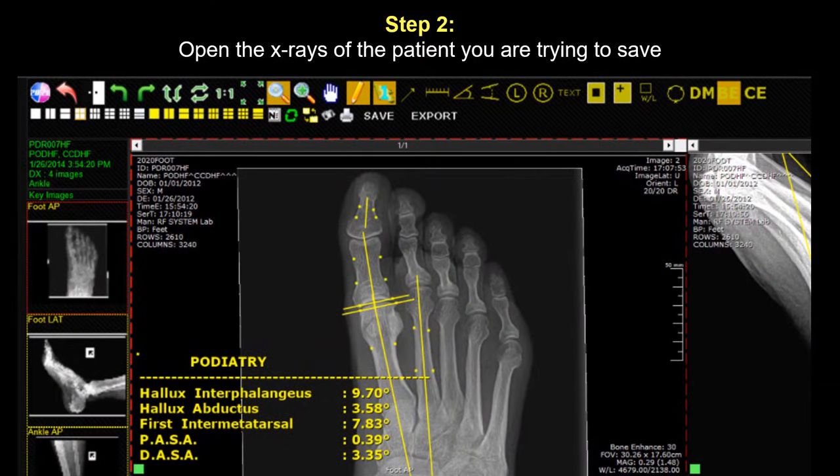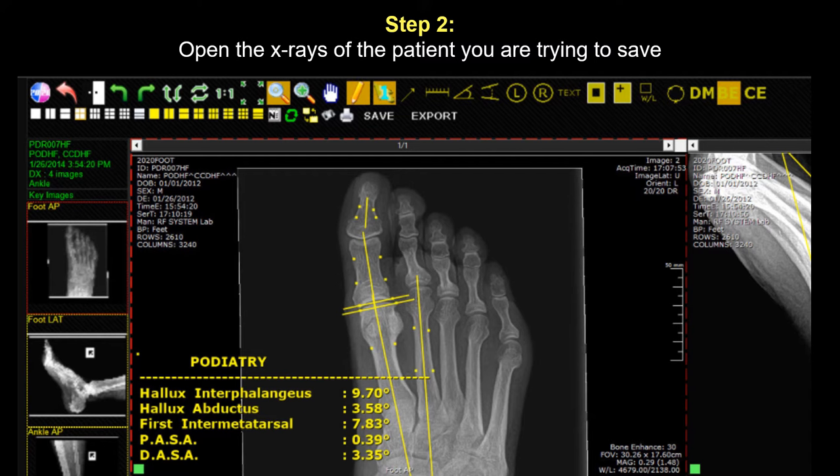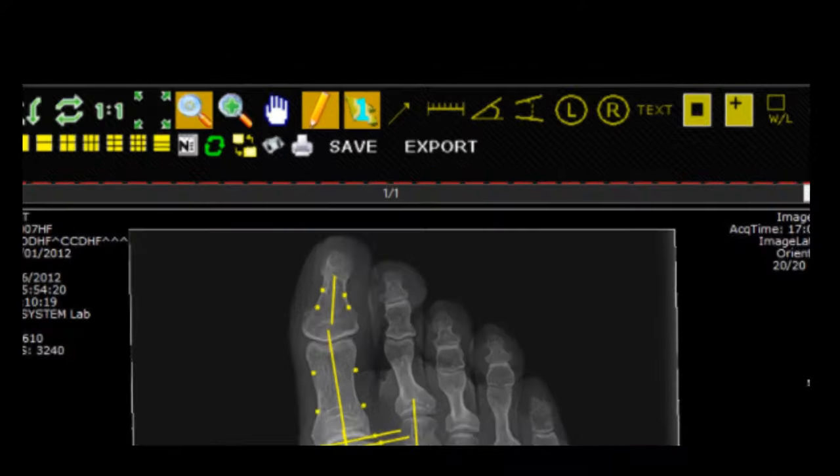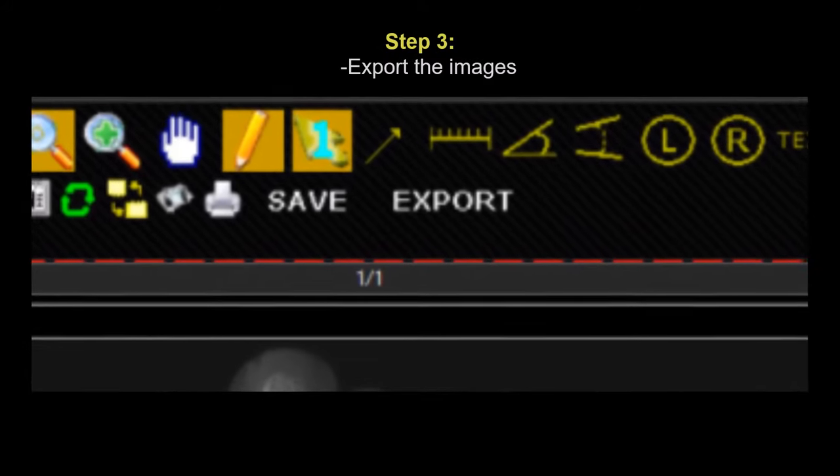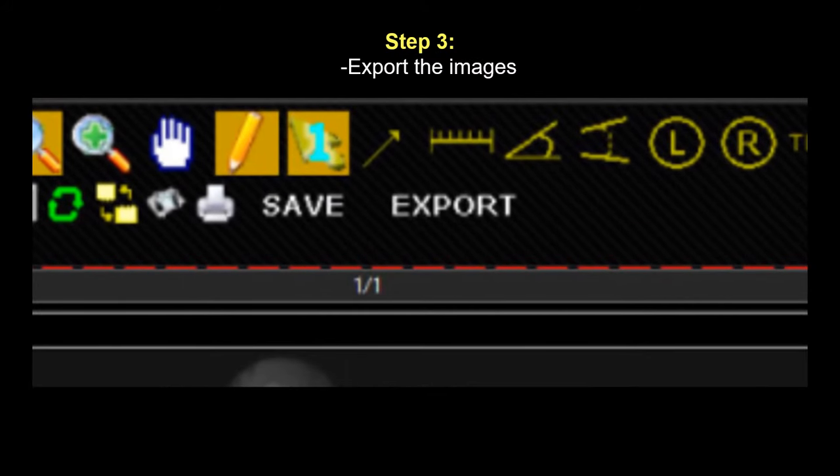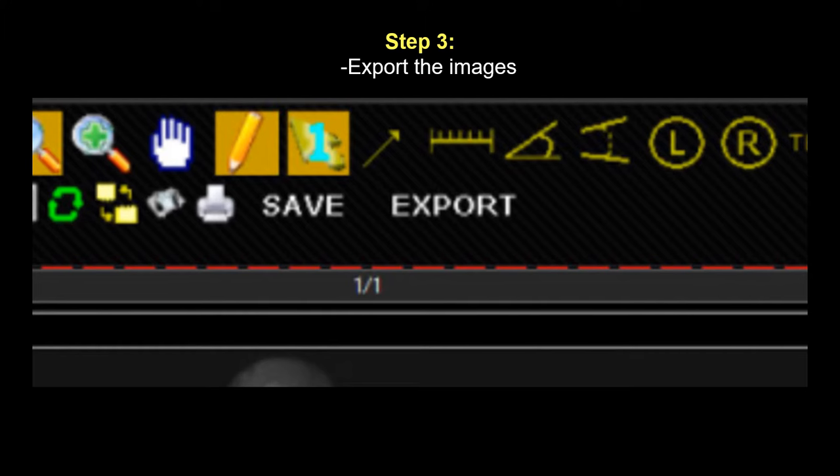The second step is to then open up the PACS viewing software that contains the images that you want to save. Next, hit the export button, and if you don't see that, hit the save button. And when you're asked to choose a format, choose the DICOM, not JPEG. And for a destination, pick the folder that you created.